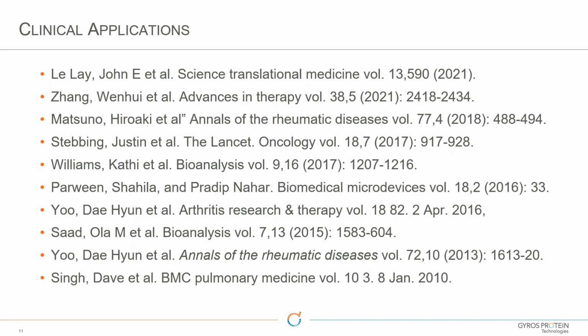Yeah, I think there have been some cases where things like matrix interference and so forth were improved by using a flow-through technique such as is available on the Gyrolab system. But I think by and large, most of the folks that are out there wanting to reduce the human variability, and the art of doing a plate-based ELISA is sort of removed when you add that automation piece.